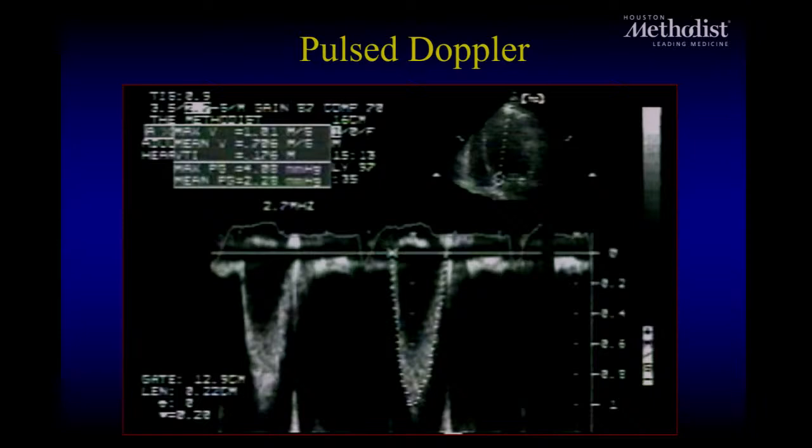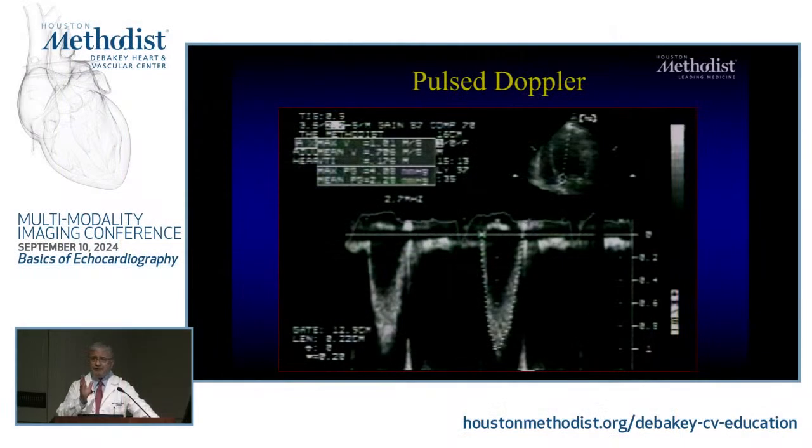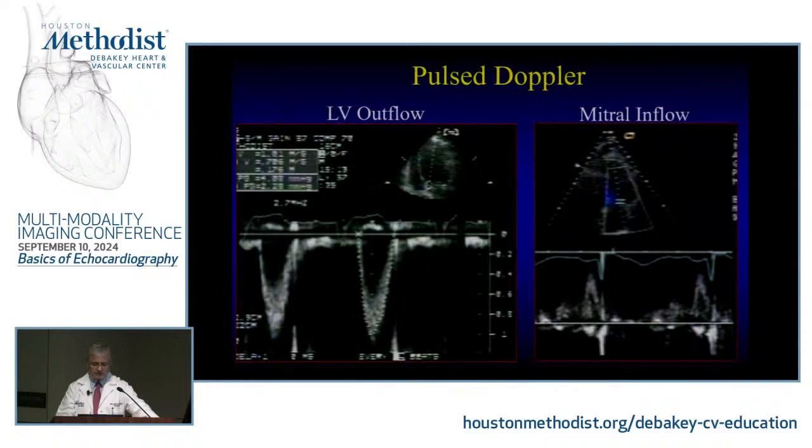And then lessening of the velocity till aortic valve closure, okay? Now, the modal velocity is the one that has the majority of these red cells, so usually it's not the maximal. But we found out that actually you're closer to the maximal velocity as opposed to the vast majority of red cells because there is some underestimation, et cetera. So we use that most of the time. And it's more reliable, more reproducible among people because I know where the edge is as opposed to figuring out where the modal velocity is.